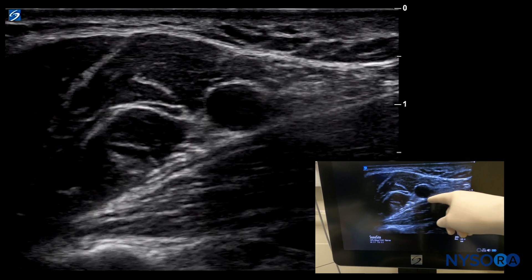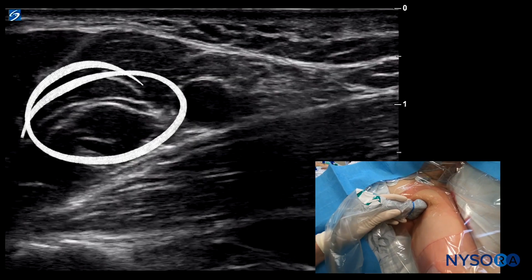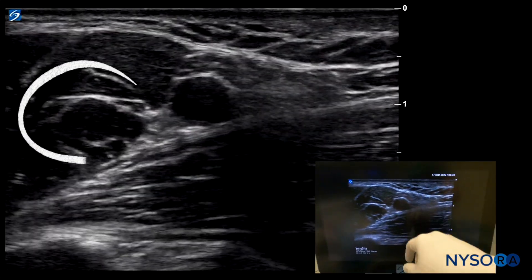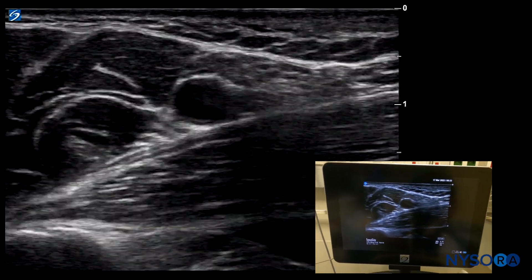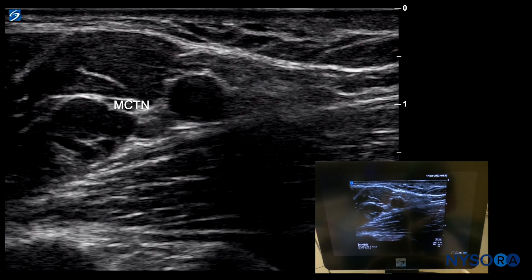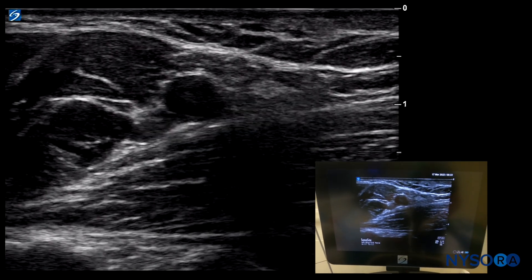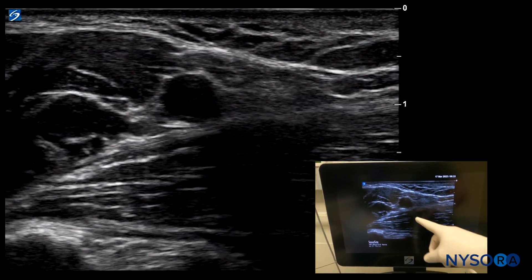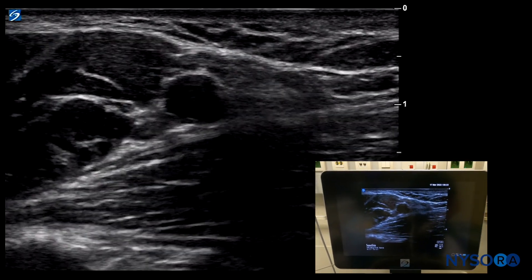Outside of the sheath we also see the musculocutaneous nerve. If we scan it more distally and proximally we can see how it kind of swims into the plexus and swims away from the plexus depending on your scanning level. That is the conjoined tendon. Everything we want to do with the brachial plexus block in the axilla is inject local anesthetic into this triangular space, which requires some decision-making: are we going to inject above the artery or below the artery first?